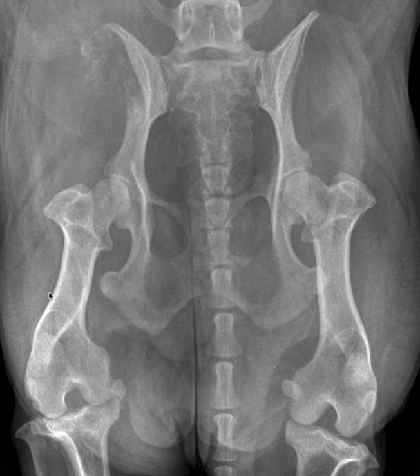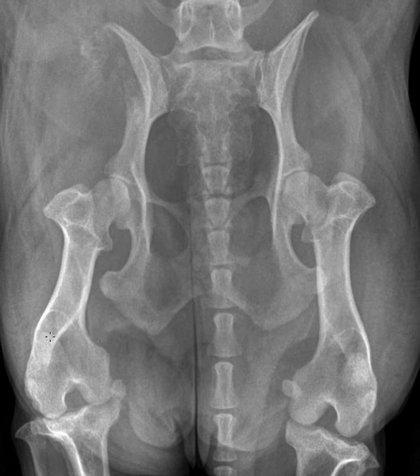Ventrodorsal hip-extended views are a great orthopedic view often because you have a built-in comparison between right and left sides. I want to make a quick note before I go into the main lesion. You might see that the patellae in this case are ever so slightly off to the side on the lateral aspect. The positioning of the femur and the angle of the tibia can really affect the apparent patellar position and can make it artifactually look luxated. So we have to be really careful when radiographs aren't perfectly straight not to over-interpret patellar position.